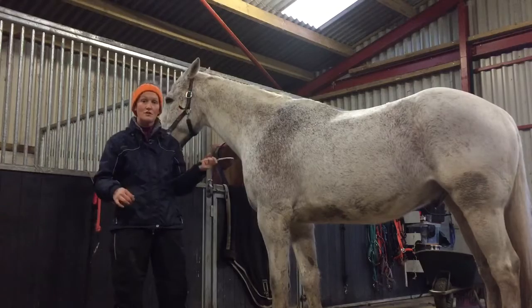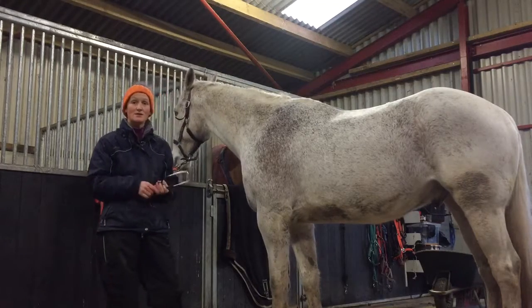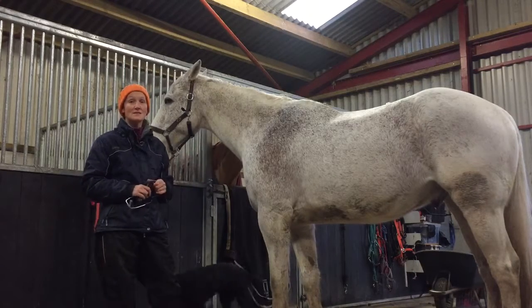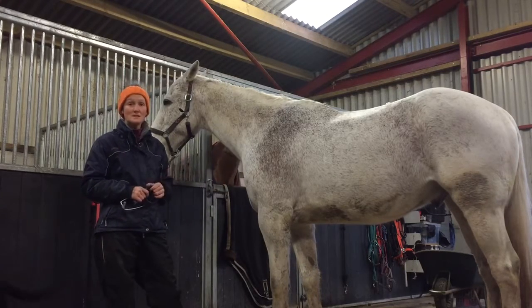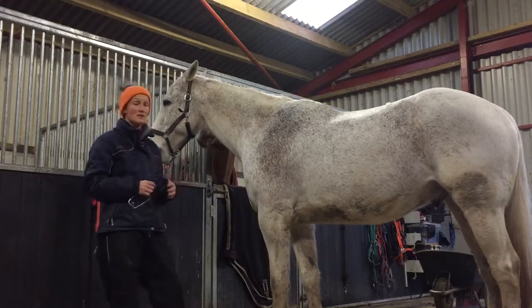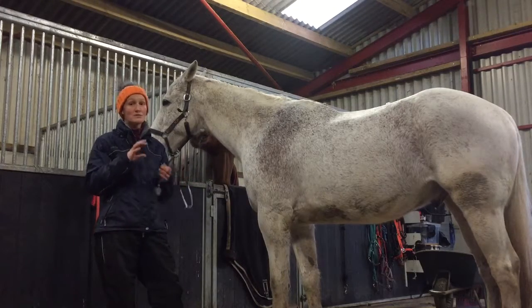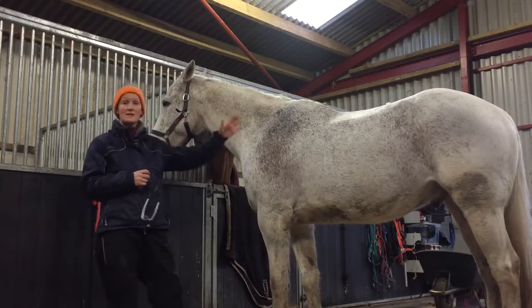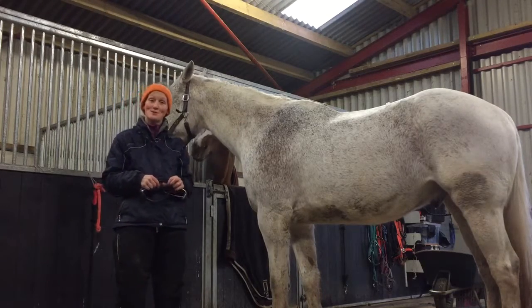We take a heart rate over about 30 seconds, times it by 2, and it gives us our heart rate per minute. A normal horse's heart rate is anything between 32 and 40 beats per minute — that's a normal reference range, although many books vary slightly on either side. We take that as part of our clinical exam. Thank you very much for watching.